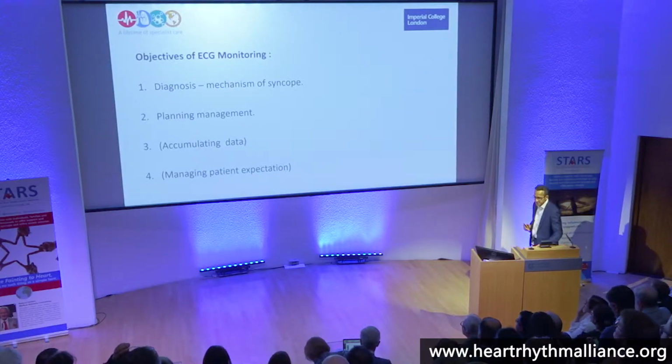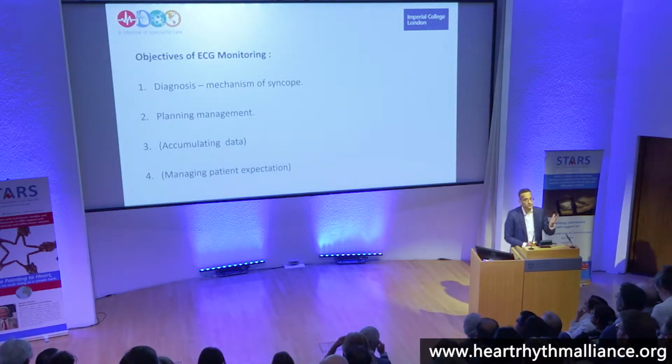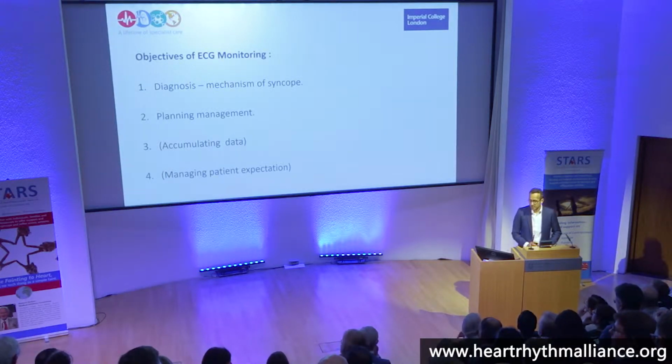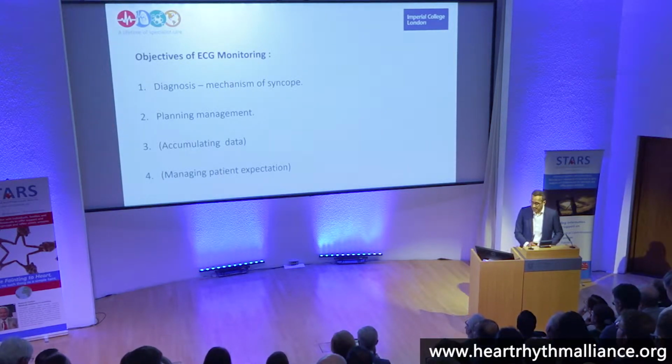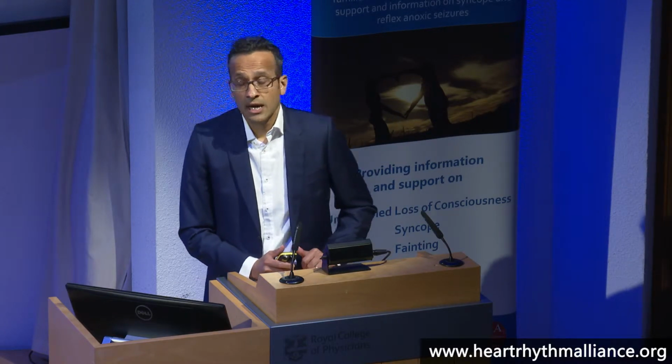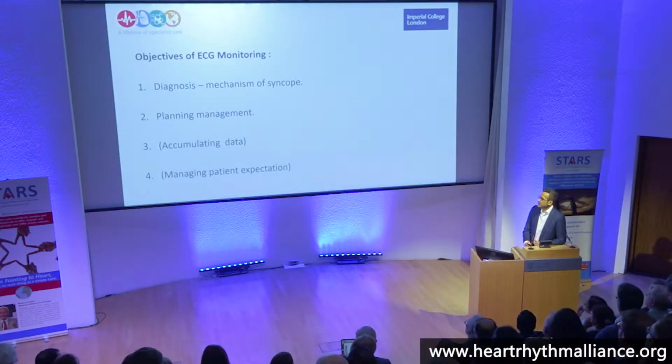So what are the objectives of ECG monitoring? Well, first and foremost, to define the mechanism of collapse, be that arrhythmia or otherwise, okay? And that's in effort to plan management. Because to be quite frank, the diagnosis usually will come to your minds within 15 minutes of your consultation. So you're really doing your monitoring to see if there's any specific therapy vis-a-vis pacing, which may be of use.